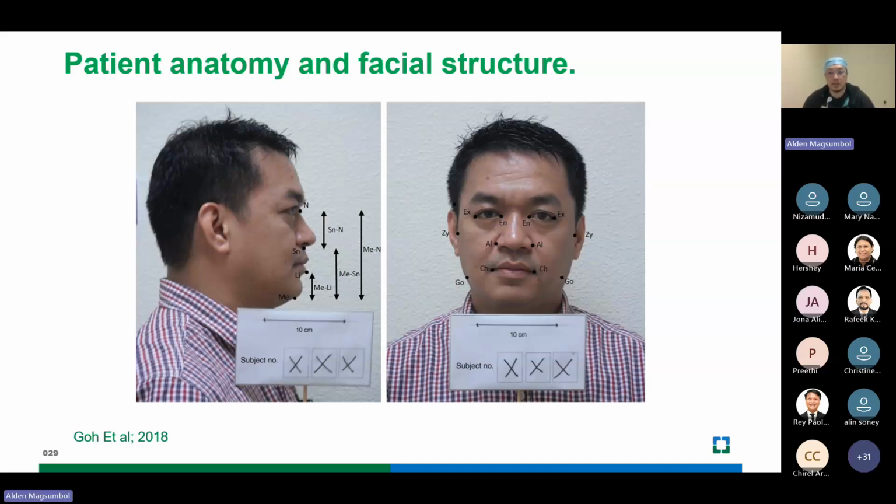I like this study because it is the first randomized CPAP interface trial in an Asian population, with a good distribution consisting of Chinese, Malay, and Indians. What they did was a randomized crossover trial involving Asian patients with OSA, comparing nasal and oronasal masks in terms of efficacy, comfort, adherence, and each patient tried both types of masks during CPAP titration.